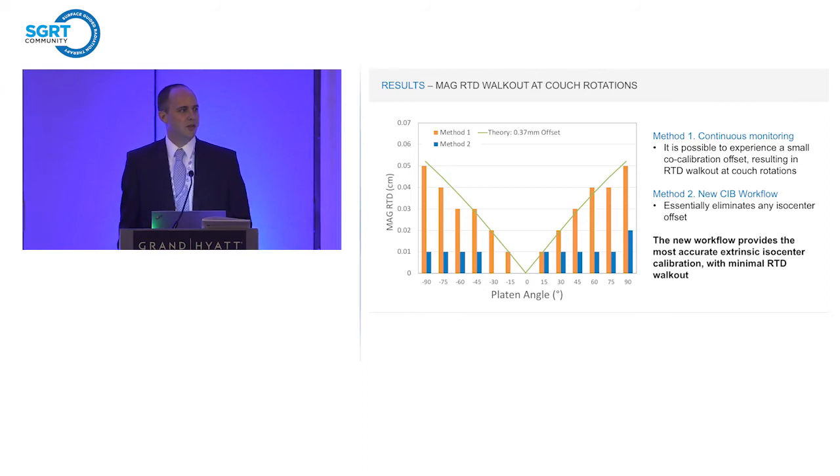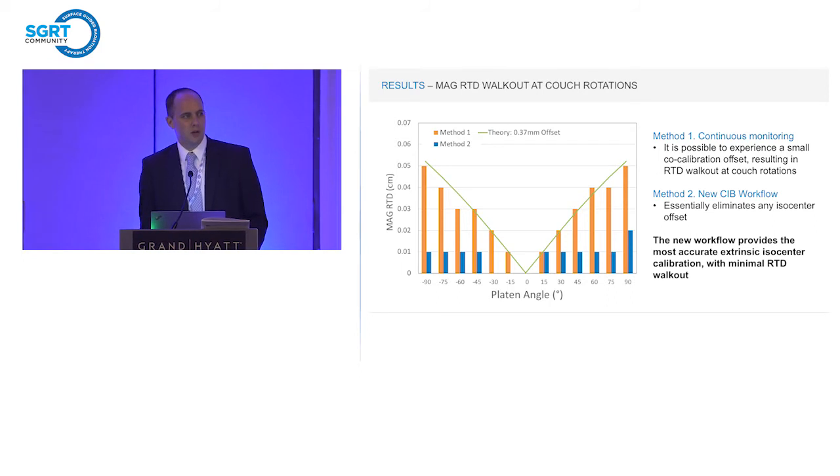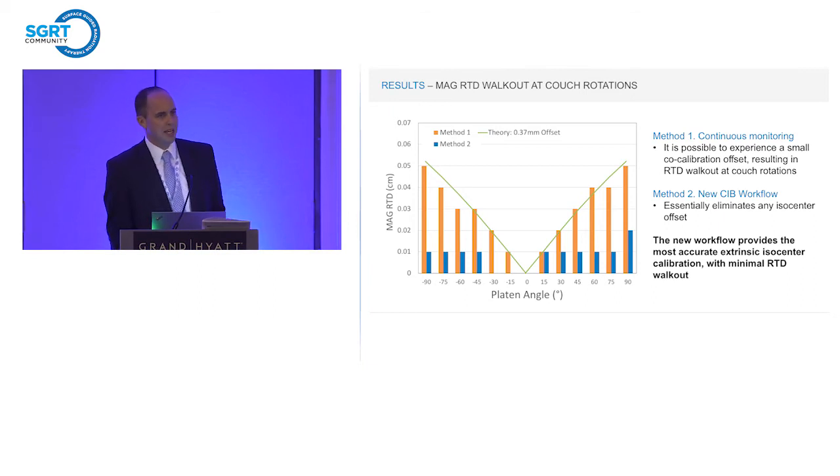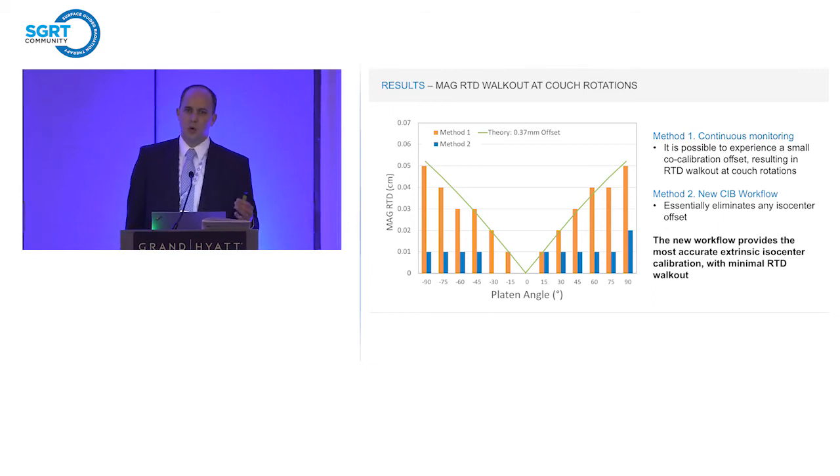And I think hopefully I've shown that this is important when you're treating with couch rotations in particular. You want to make sure you have the best coincidence of those two isocenters. So again, if you haven't seen this new workflow, I would suggest pick up a copy on your way out and talk to me about it as well. We can discuss that. But I think this is key, and like I mentioned before, if you are rotating the couch and you're seeing routinely more walkout with the real-time deltas than your couch walkout should suggest, then the chances are you have an offset.